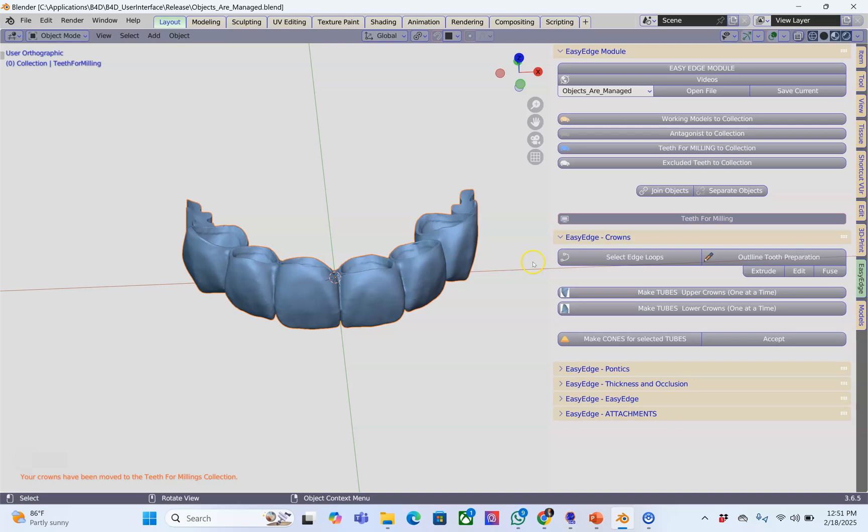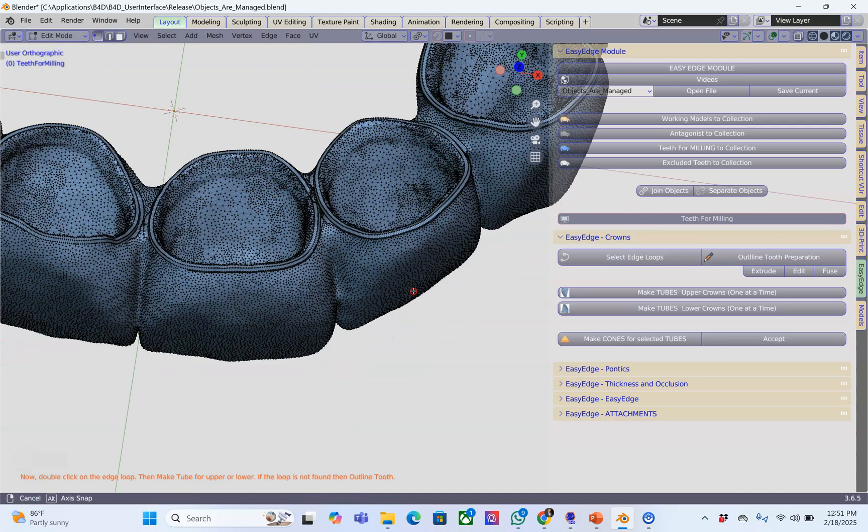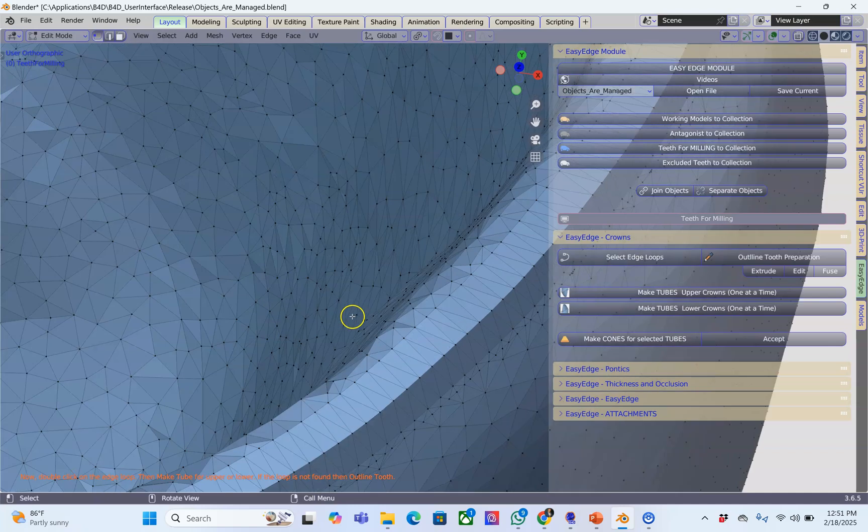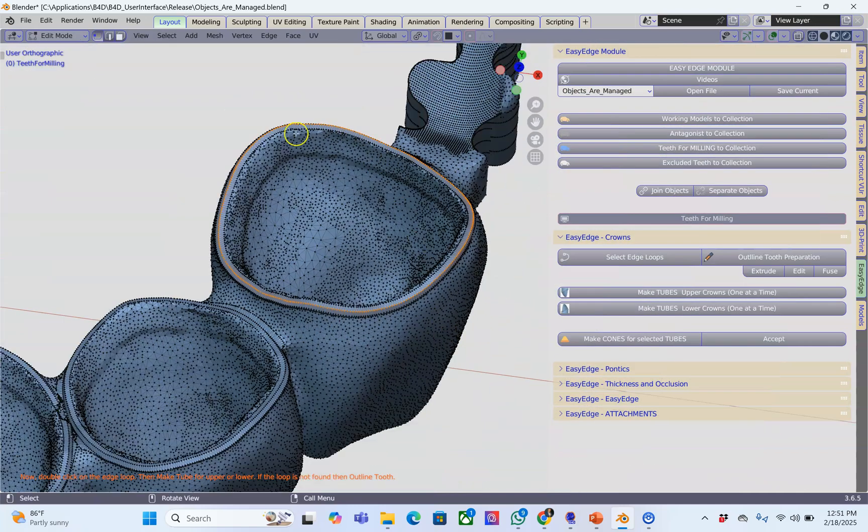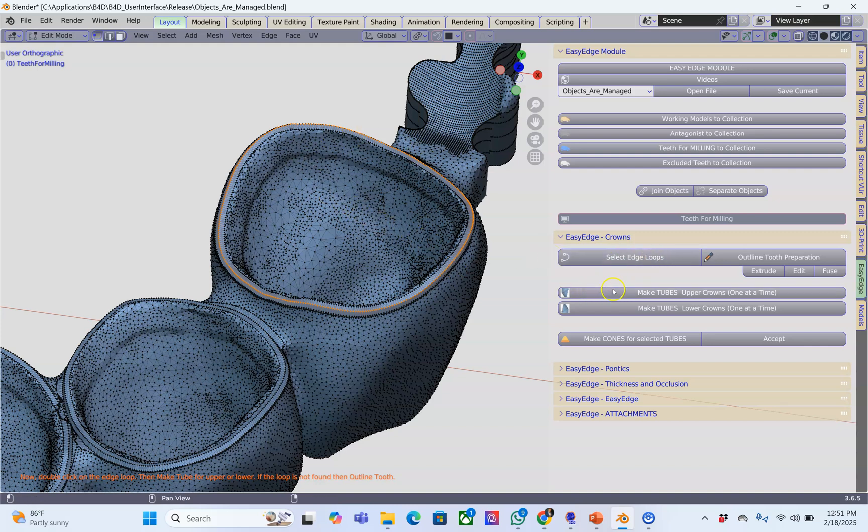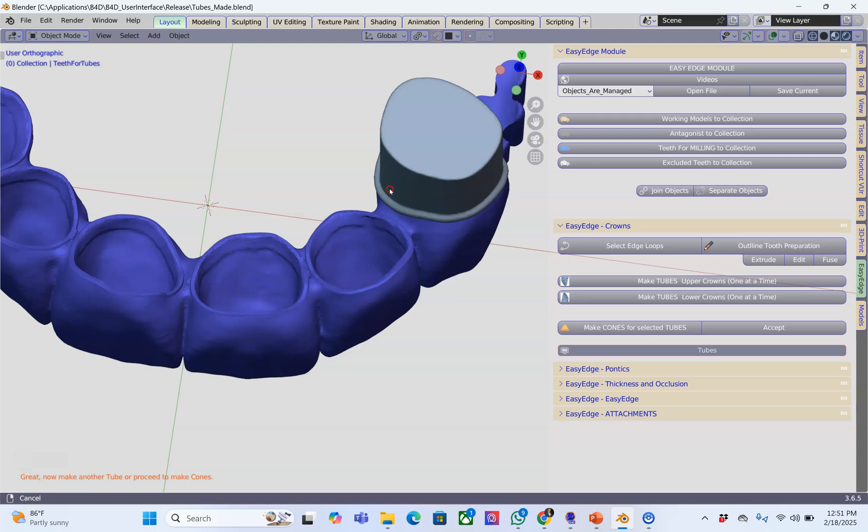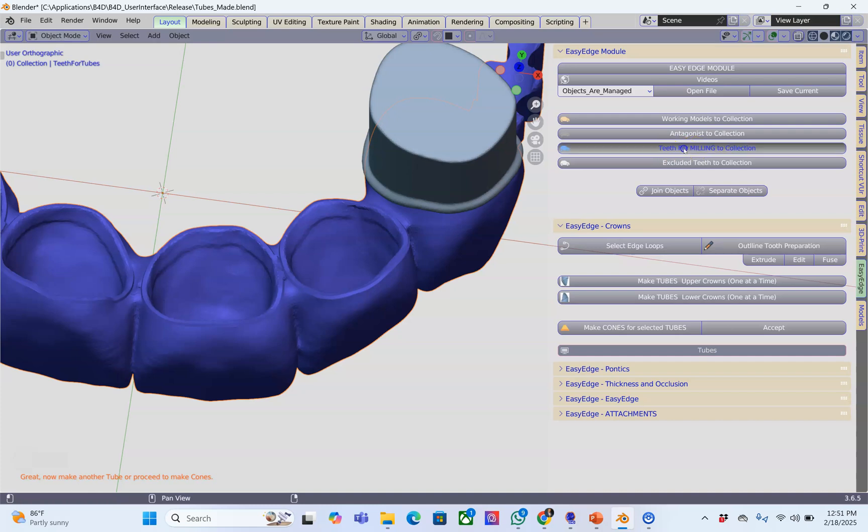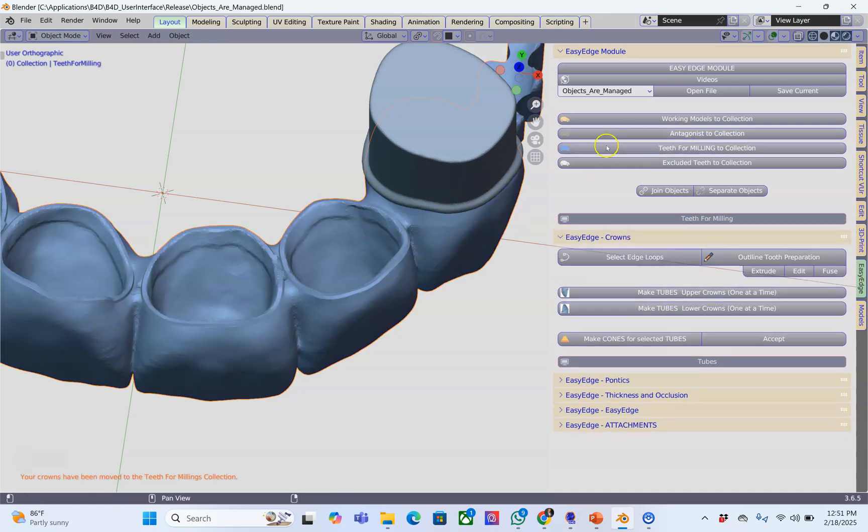The next step is to select the bridge and allocate an edge loop going all the way around. This is usually the margin of the crown. The purpose of this is to make these objects tubes that safeguard the inside of these tooth preparations. We're going to flip this into the collection. For a bridge you always have to put it into the collection.